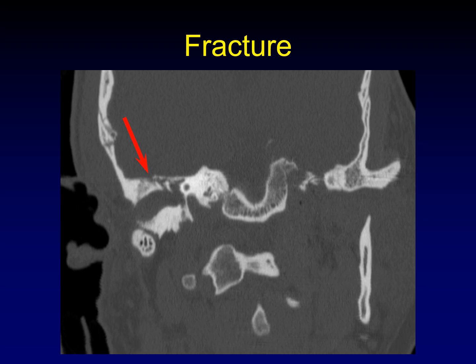Here's an example of a temporal bone fracture running up through the tegman. It's sometimes easiest to appreciate on coronal imaging; I find sagittal imaging helpful to appreciate the superior extent of the fracture. Remember, these are not fracture lines — they are fracture planes. Once it comes up through the tegman, it must continue out through the skull somewhere, so it's important to find the full extent of those fractures.